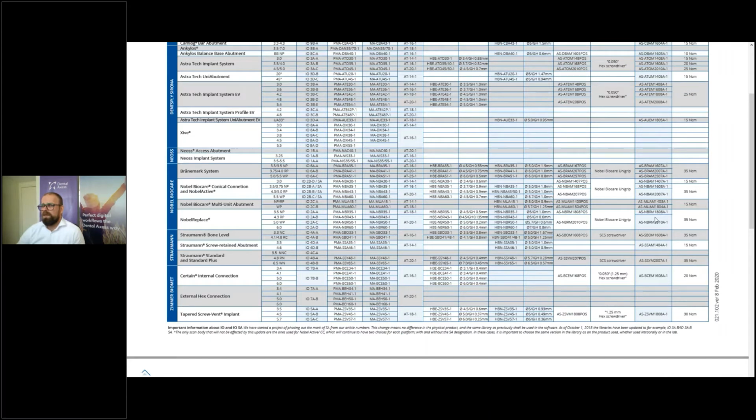Again, like I said before, it's so important that you and your clinician have the same information, are on the same page. Sometimes you get a file and you have no idea what kind of implant scan body is used. We're not magicians, and we don't want to waste our time. Ring up your clinician and say, what is it? What do I need? And make sure.